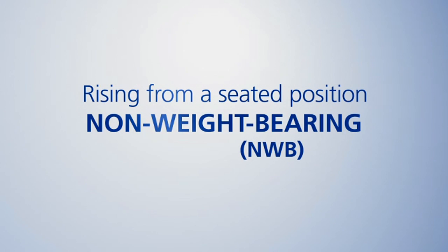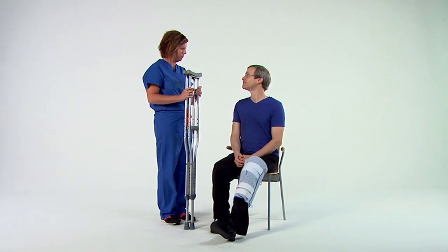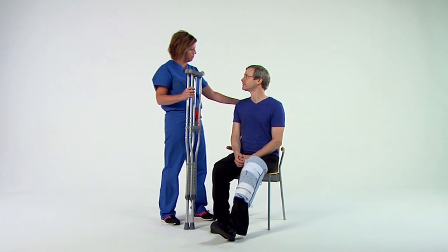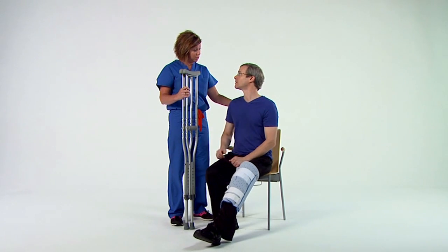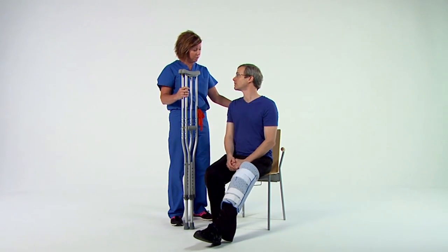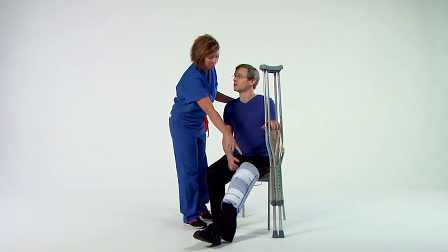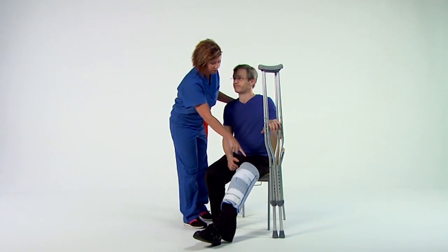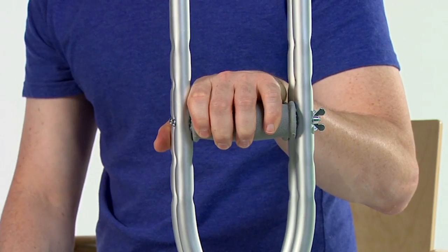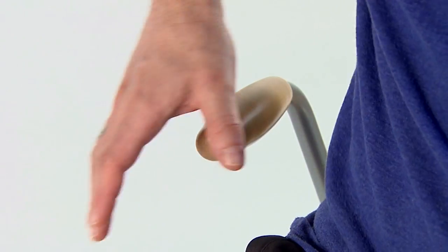Rising from a seated position, non-weight-bearing. Rising from a seated position can seem challenging. Please be sure that a member of your care team is present before you attempt to try this on your own, either in the hospital or at home. First, you'll need to place both crutches on the same side as your injured leg. Be sure that both crutch tips are placed firmly on the ground. Next, grasp both crutch handles using the hand on the surgical side while your other hand is placed beside you for support.